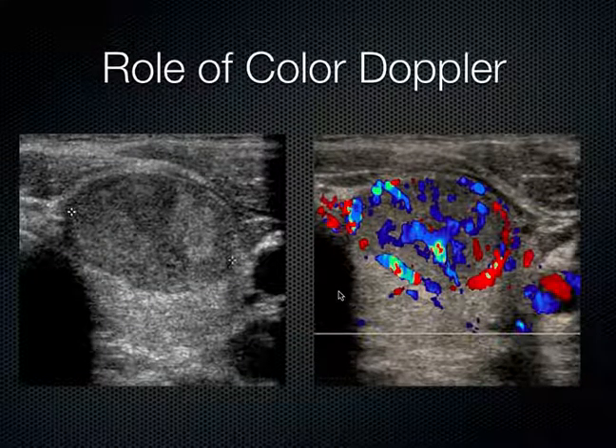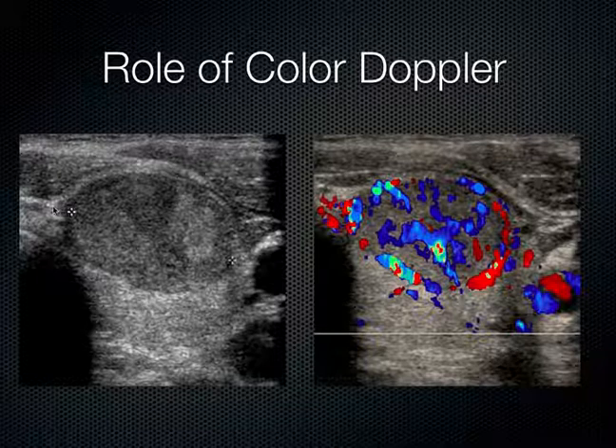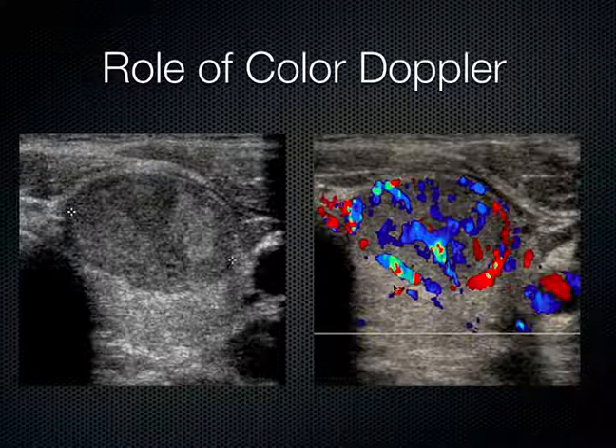This is a side-by-side image of the same thyroid nodule demonstrating the role of color Doppler. On the image on the left, you see a grayscale predominantly solid thyroid nodule — this is the thyroid nodule; the rest of the normal thyroid tissue is down here. When we add the color flow, we can see marked internal vascularity. When you see all this vascularity, it really suggests a higher likelihood that this nodule is malignant. And this patient did indeed turn out to have a papillary carcinoma of their thyroid gland.